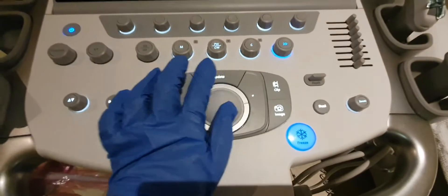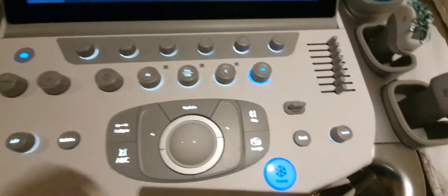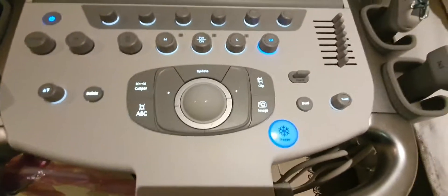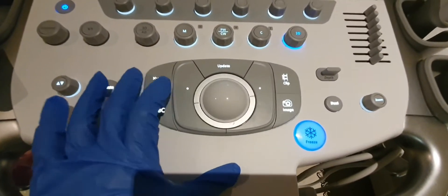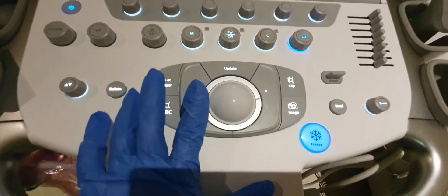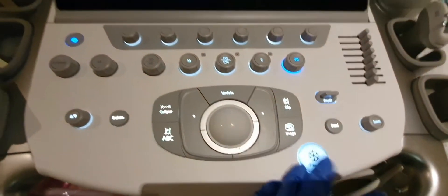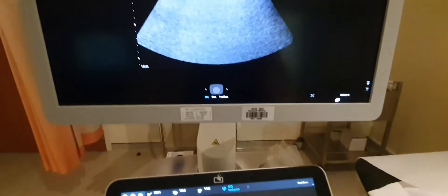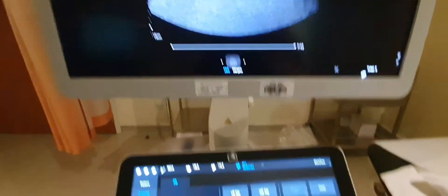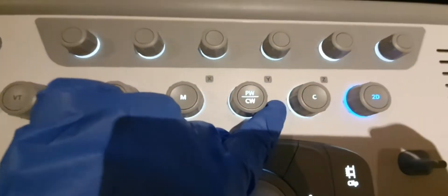For example, if you want to get the color Doppler of the CBD — the common bile duct — you freeze the image and then press the color button.